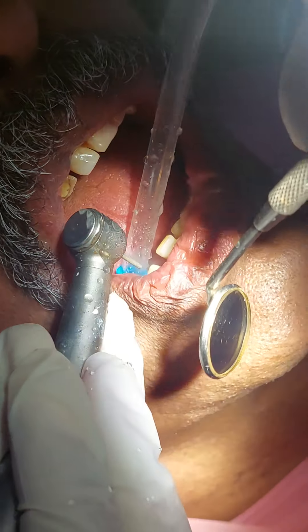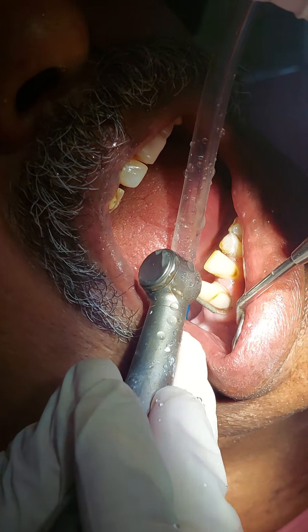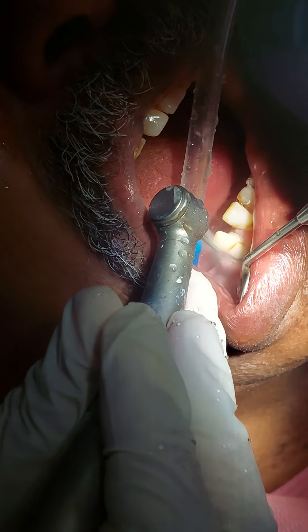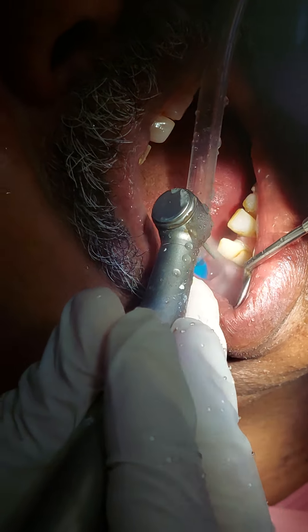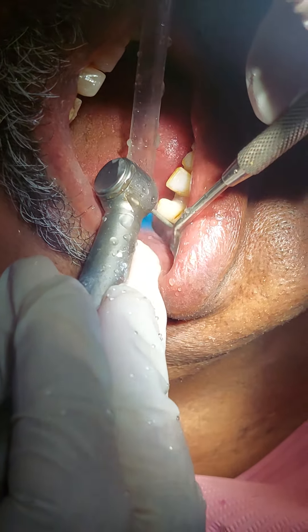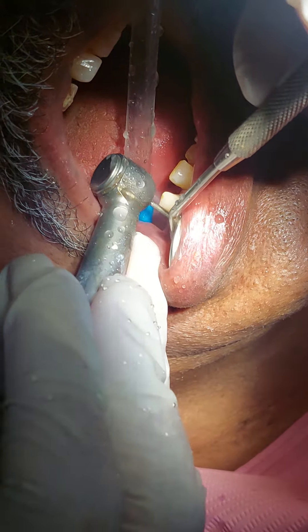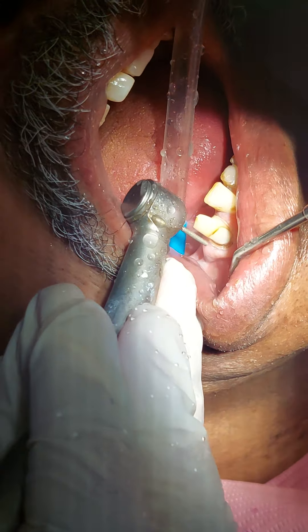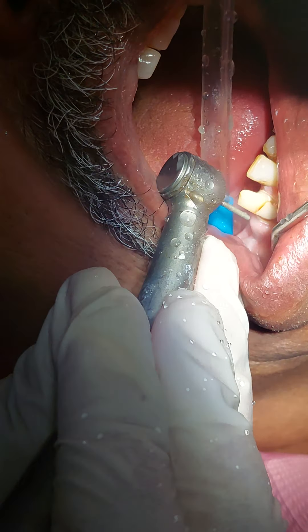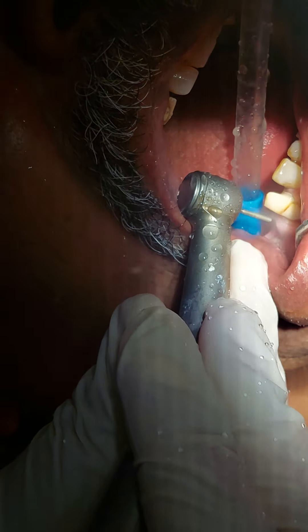While I'm preparing, if I notice that I'm touching the gingiva, I would prefer the method where I put a retraction cord to move the gingiva away and also guide me how much is left inside the pocket. So I brush this and in the correct taper I found another undercut — you see this big undercut here? The camera can't see it, but I'm removing the bulge here. The undercut is here and I'm removing the bulge here.